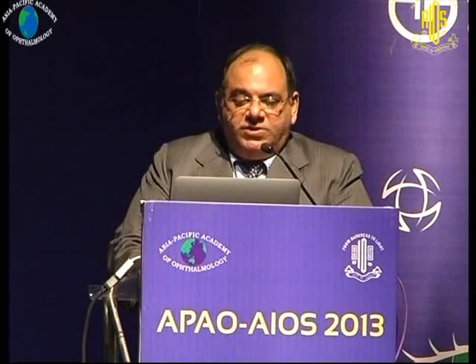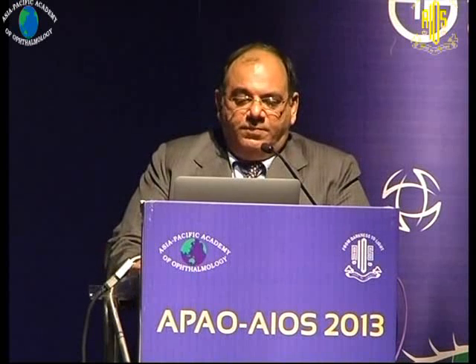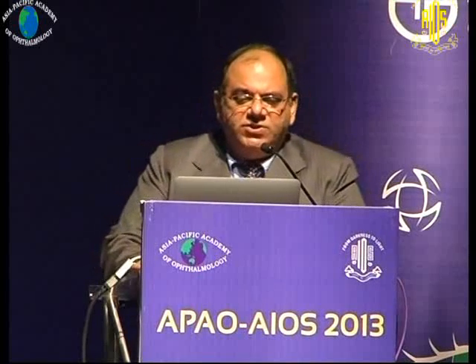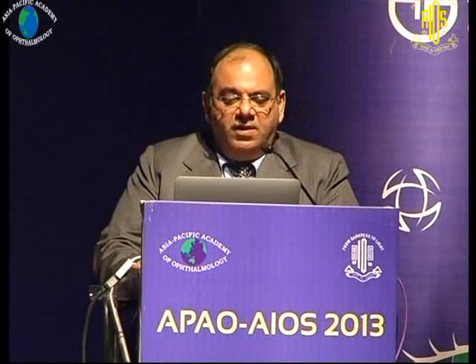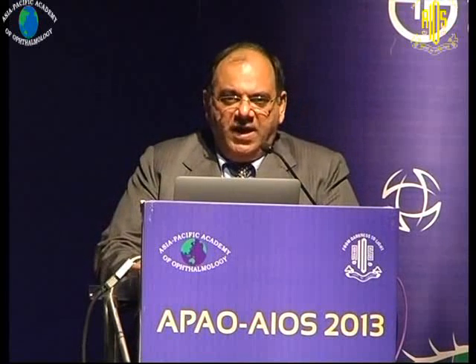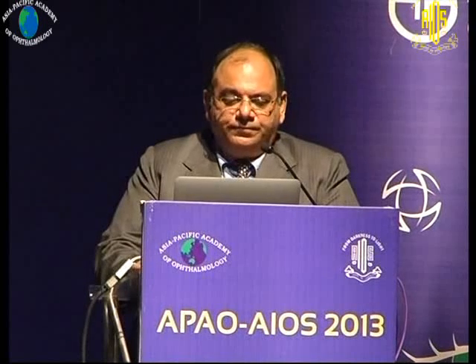Well, normally the procedure which we do is place the infusion line, or with the co-MICS approach we might just go and do a phaco straight away. The IOL is implanted. The wound may or may not be sutured depending upon the stability of the wound itself. And the status of the eye, if it's a very myopic eye or a normal eye.